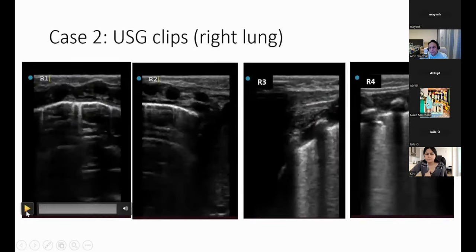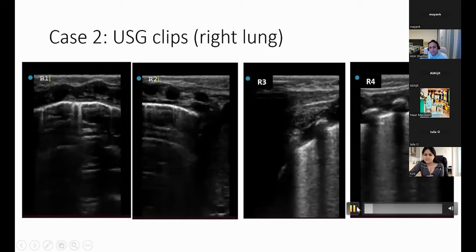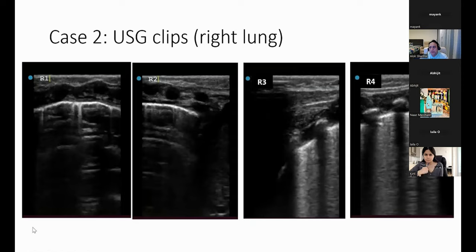In L2, do you think that on the left side there's also some loss of contact? Because when I did it for extreme preterms with that linear probe toward the lower side, there was always not enough chest space to accommodate that, and I had these blackouts. It's unusual. If you have a linear probe that's nice and long, you should be able to cover the entire chest of an extremely preterm baby with even a single scan. So maybe when we talk on Tuesday, we can have a look at how you're doing it. Okay. Go for it, Mayank.